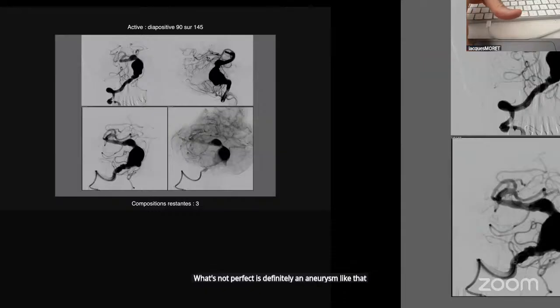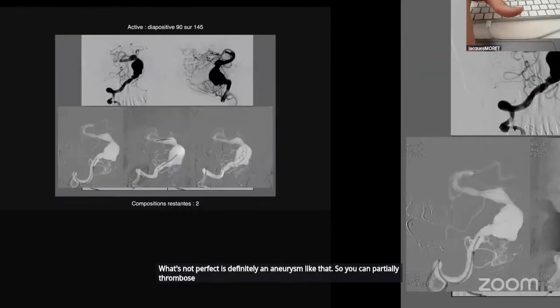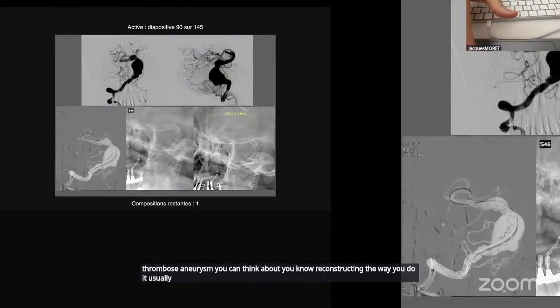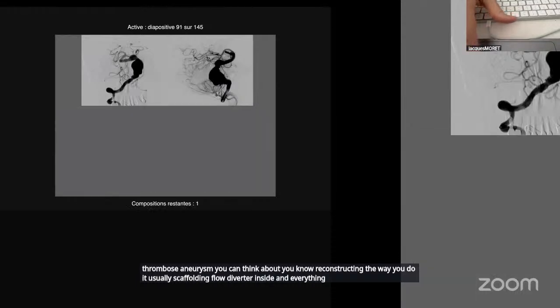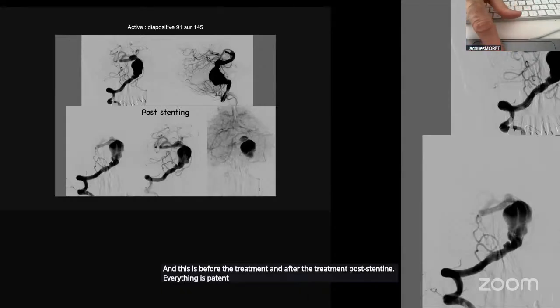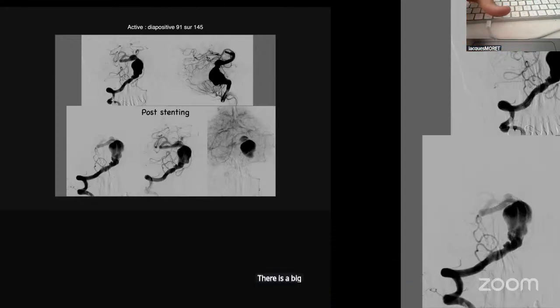So you can partially thrombose an aneurysm. You can think about reconstructing the way you usually do it, scaffolding, flow diverter inside and everything. This is the structure, before the treatment and after the treatment, post-stenting. Everything is patent. There is not too much patent portion of the sac of the aneurysm. There is a big thrombosed territory. The patient is fine.